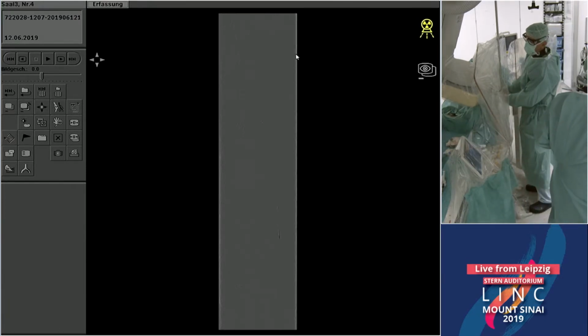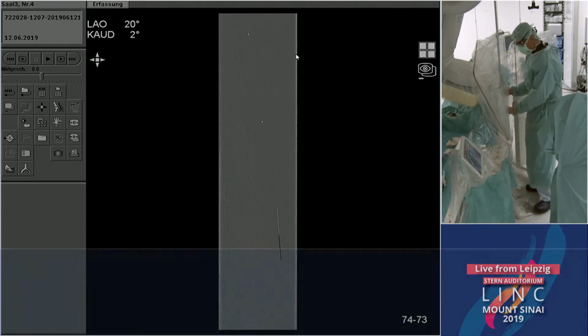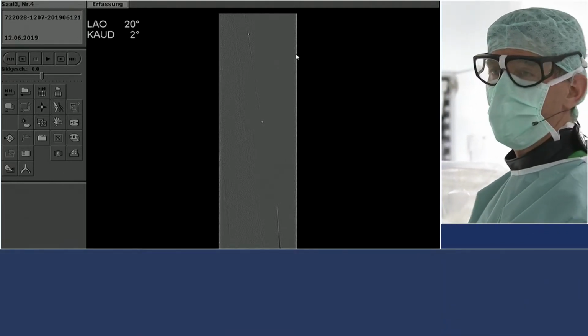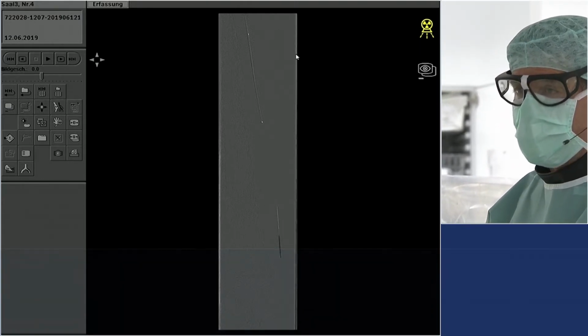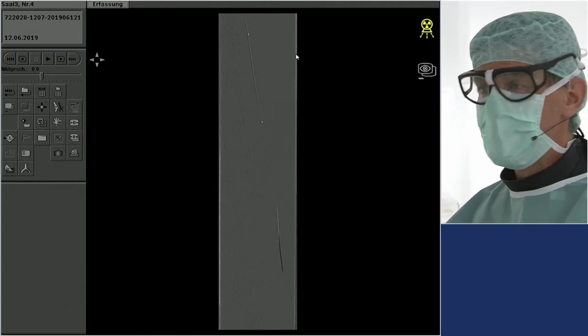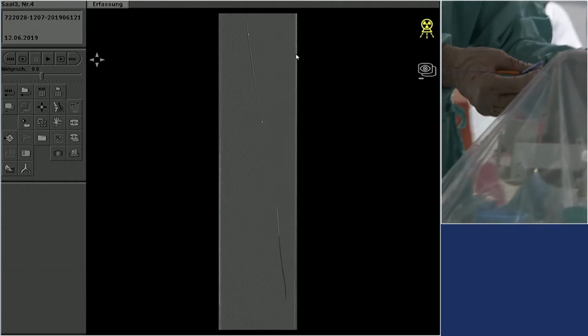Well, usually some few minutes. However, sometimes it can really be long, 15 minutes, 20 minutes. I can remember a case where even after an hour we had no flow, and the next day everything was open again. So it is really different from one patient to the other. And surprisingly, sometimes also in very calcified lesions, you can see quite some spasm.